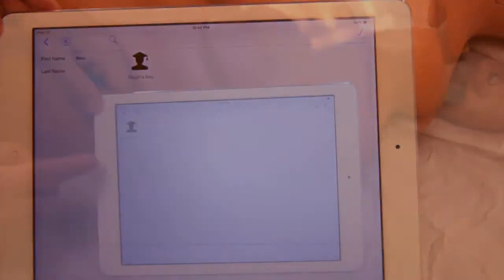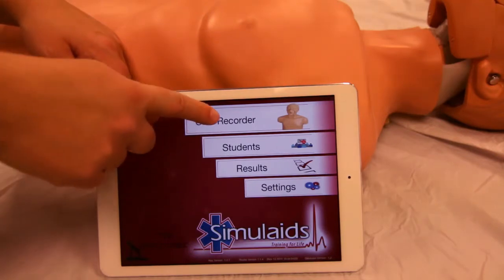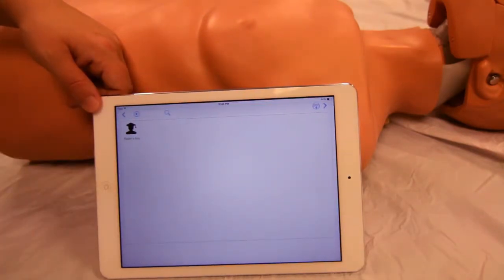Running the simulation: start the CPR recorder. Note the CPR recorder button pauses as it links. Select a student and tap the arrow.